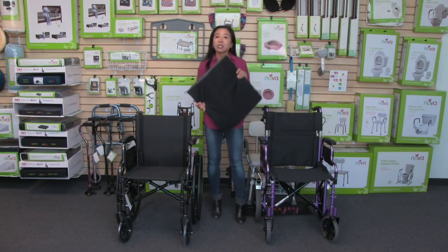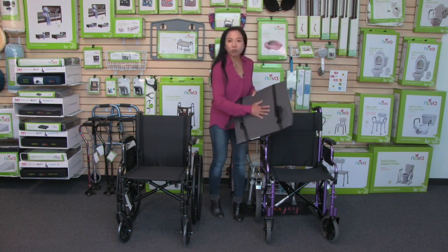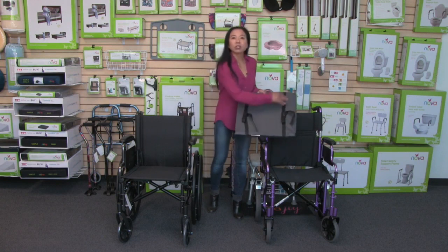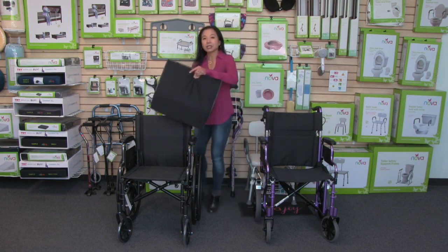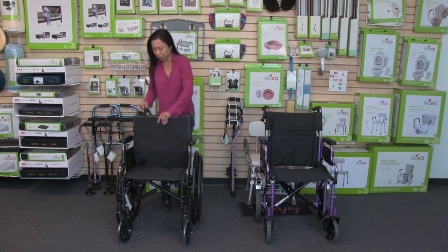This cover is removable and washable, and the back of it is waterproof and also has a skid-resistant material. This lumbar cushion comes with dual straps on the back, and that makes attaching it to a wheelchair really easy and keeps it nice and secure.